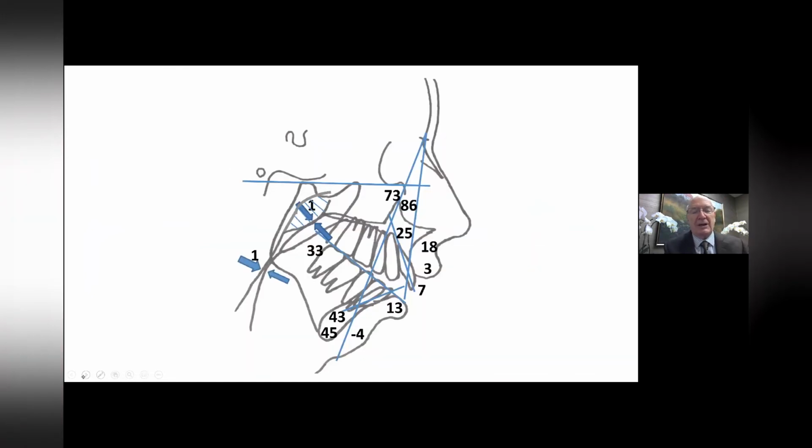And here's her cephalometric analysis. And look at the steepness of her occlusal plane here, 33 degrees. Remember, the normal is 8 degrees. The other thing that she has is severe constriction of her oropharyngeal airway, only about a millimeter airway. She has to really struggle to breathe. So we're dealing with multiple issues here, significant jaw deformity.